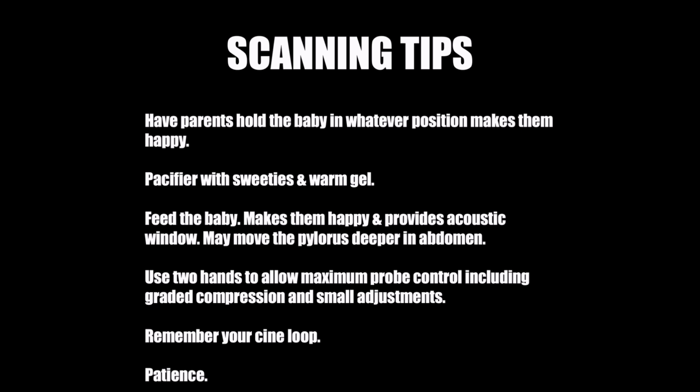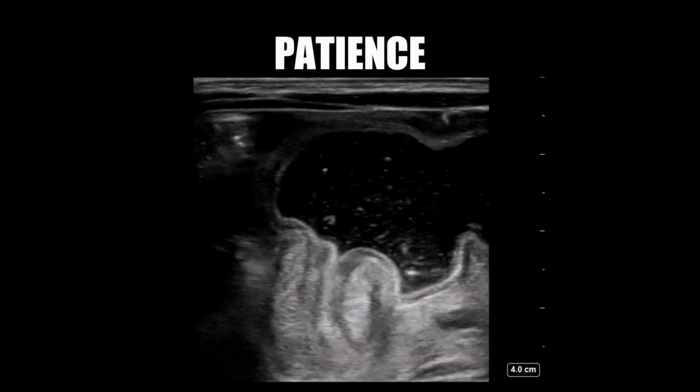These are not going to be patients who just sit still for you to get those crisp images. It really does take a lot of patience to get this study. To emphasize that, here is a still frame from a pyloric stenosis study. This is actually a fairly clean shot.